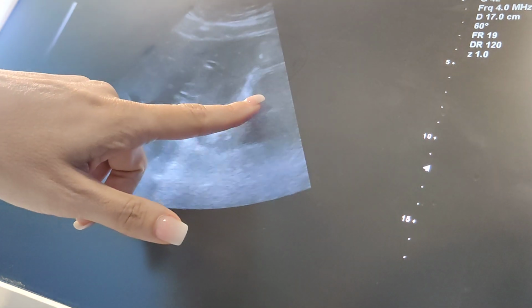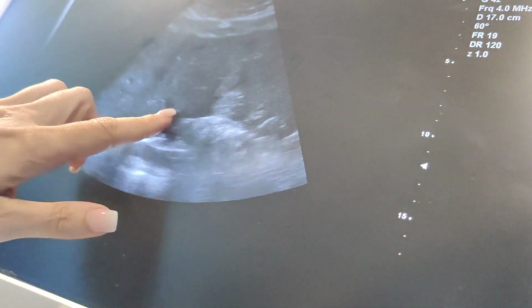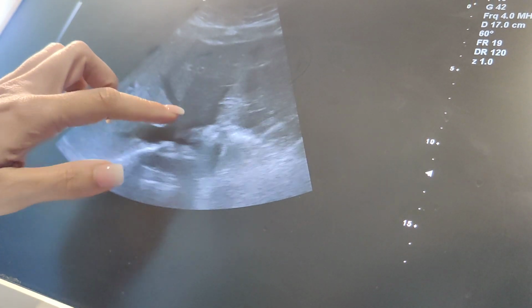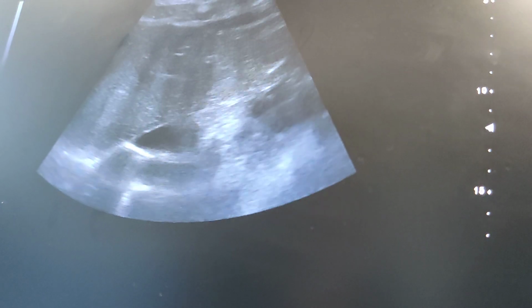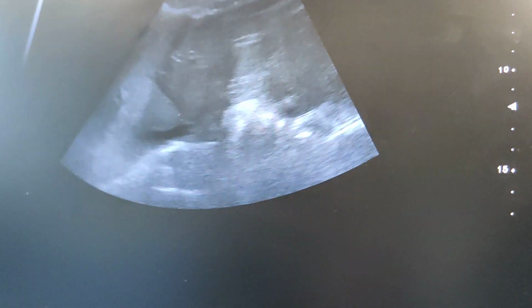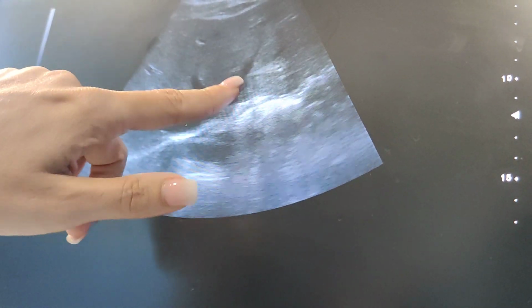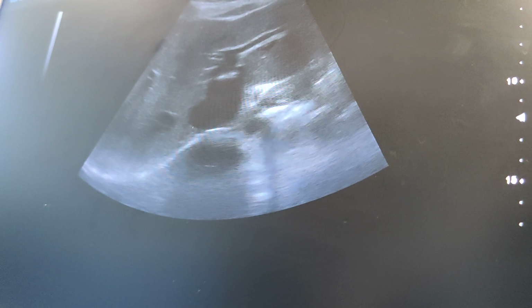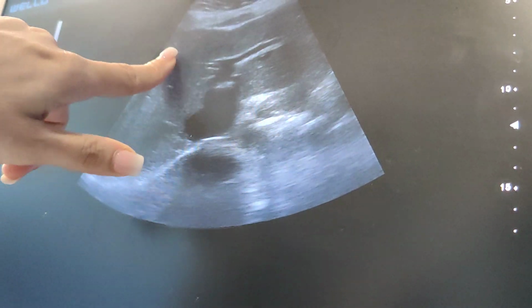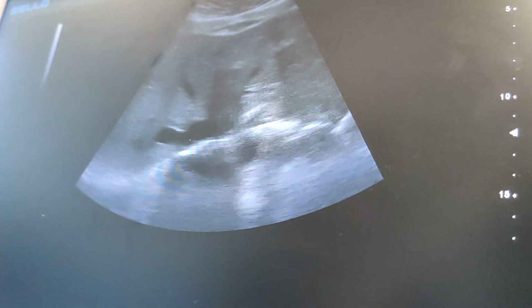So I want to again be sure that I'm evaluating the entire left lobe. We can see here the hepatic veins, right? Breathe in. I'm going to have you do it again, sorry. Middle hepatic vein, left, and then we can see IVC here. If I sweep down just a little bit, that's my left portal vein. We call it the portal T. So I know that I've got left portal.